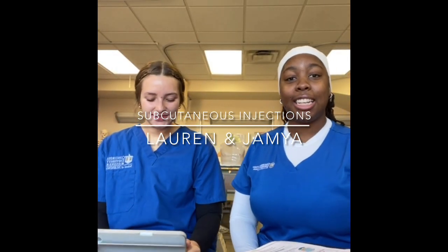We'll be demonstrating today how to properly give subcutaneous injections, specifically insulin. We'll be covering subcutaneous injections, how to draw them up and administer, and then some key nursing considerations.